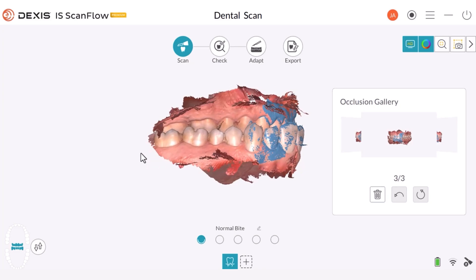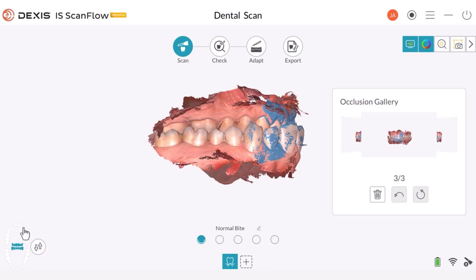Let's explore how we can correct this. If the arch is mislabeled, you don't need to stop during the scan to correct it — you can come back and fix it later. As you can see, there is a button here that you can select to switch the upper and lower arch. As I point to different areas, a little tooltip pops up that lets me know what will happen when I click that button.